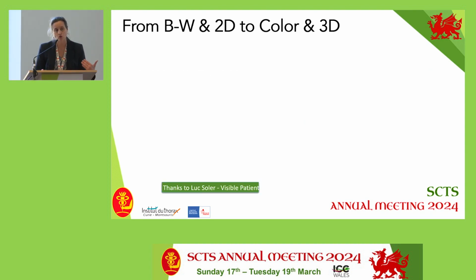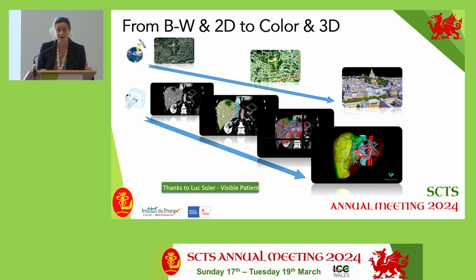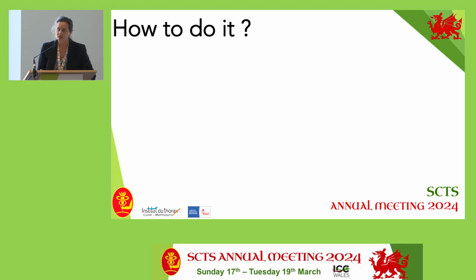It's just like if I try to explain why you prefer a map and Google Street View, for example, if you are quite lost somewhere else. So that's the similar option coming from the CT scan to a 3D reconstruction. So how can we offer that for the patients?